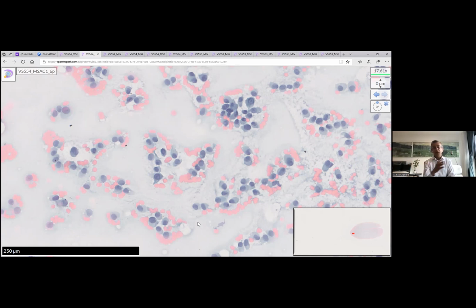Statistically, if you see appearances like these, think melanoma first. Then, depending on the confidence with which you're able to make that diagnosis after having spent a couple of minutes looking at the PAP and the Giemsa, putting them in some sort of order, say: I favor melanoma, and I would confirm this by doing two melanoma markers and maybe one pancytokeratin, such as MNF116, to exclude carcinoma.